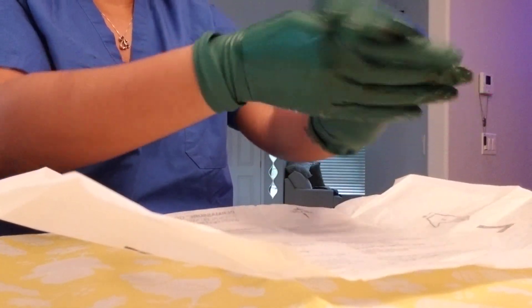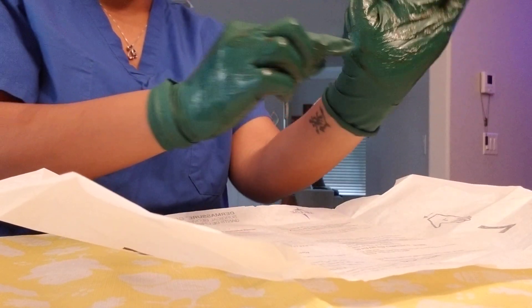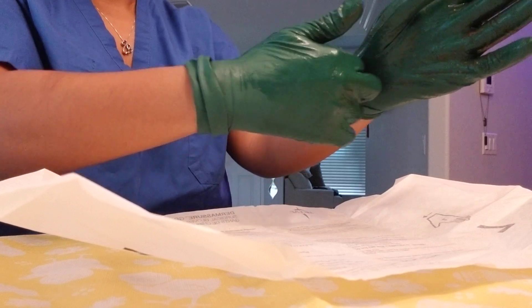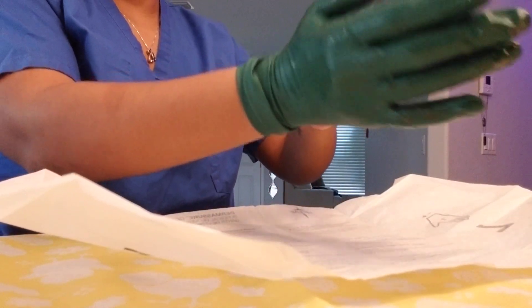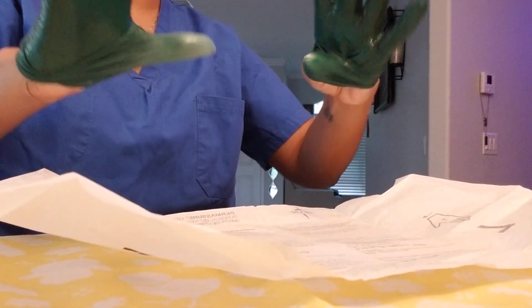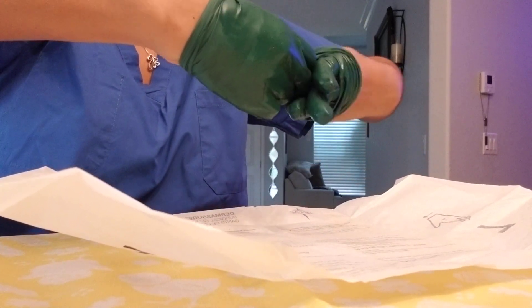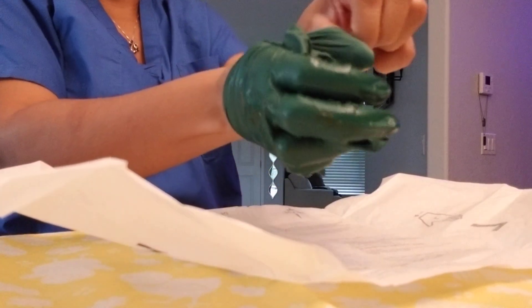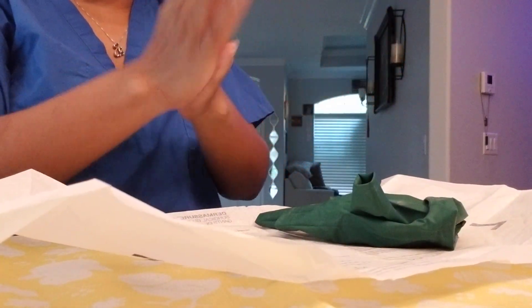Soil the gloves again — they're contaminated. Now I'm going to pinch right at my wrist, pull out, and cover my thumb, which gives me a clean area to work with. Do the same on the other side — pinch out, pull over my thumb, come in and grab and pull away. Ball it up, come under the clean area again, pull out. Hands are clean, nothing touched me — good to go.